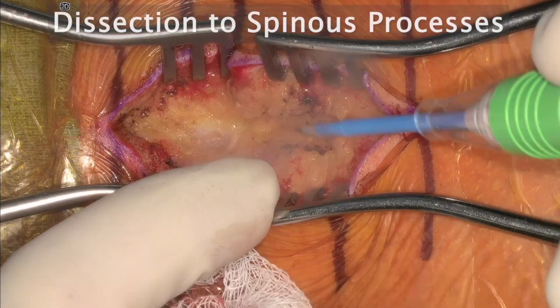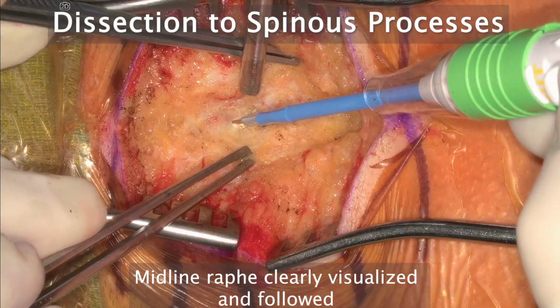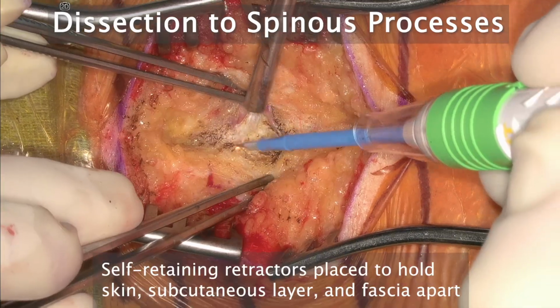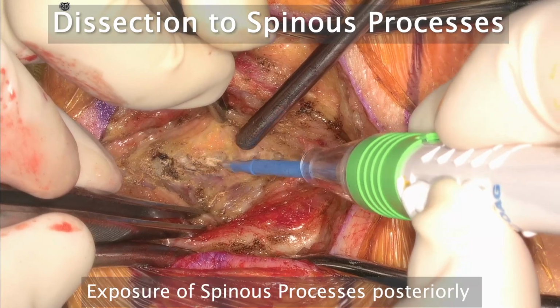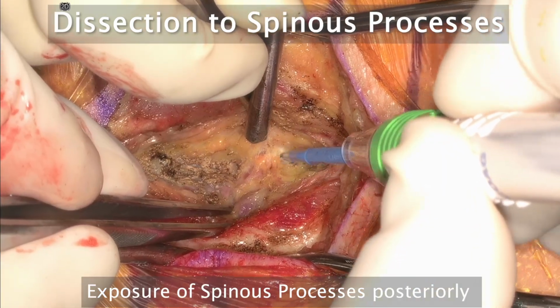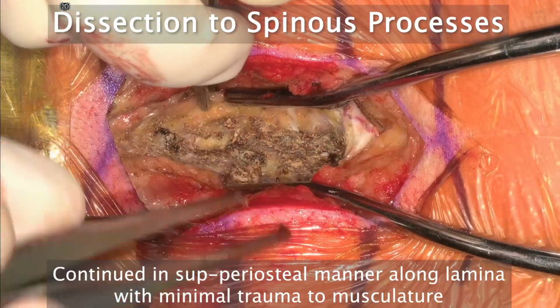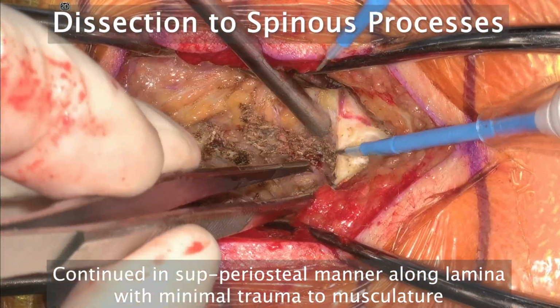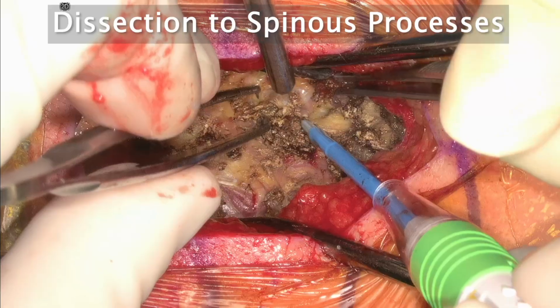Laminoplasty is a posterior approach. As you can see, we like to mark off, we're working superiorly and inferiorly from, so you see that C2 and C6, and in between we have markers marking off those spinous processes. We're also operating midline, so one thing you'll see is we found that midline raphe and followed along with that, allowing us to, one, prevent injury to the muscles as well as limit the amount of blood loss.